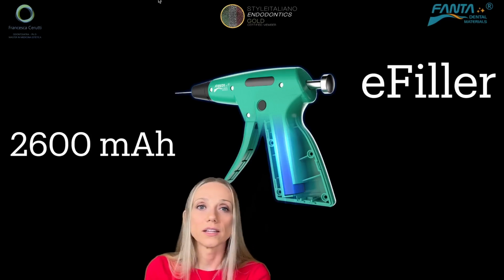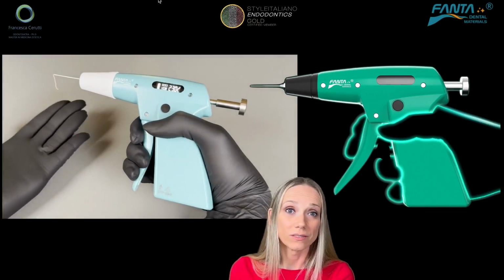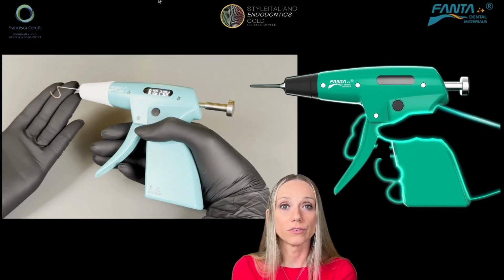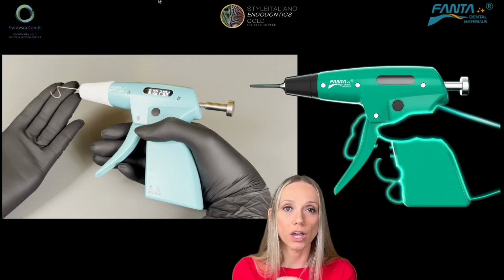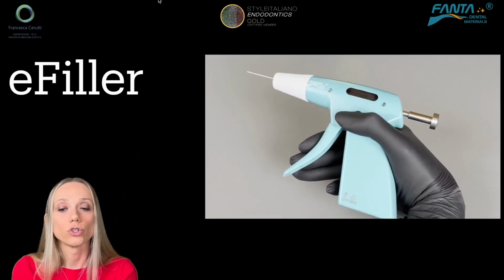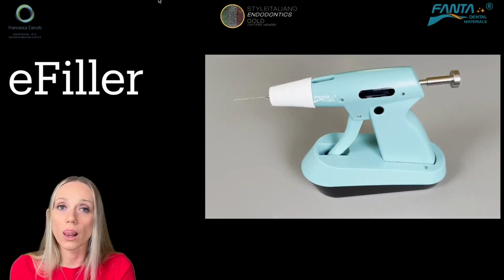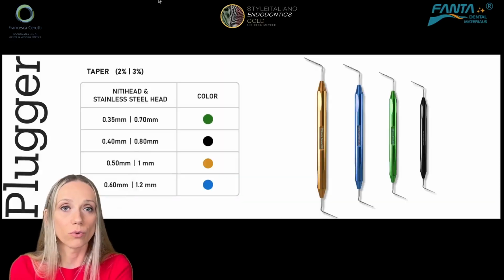And still, as the other device, the e-heater, it has a good standby time. It is quite easy to use with your hands. There is no particular problem in keeping the device straight or in the correct position. It's a good ergonomy, and then you just have to press and the gutta percha is going to be heated and is going to flow outside of the needle. So you put it into the root canal. And then what do you have to do? When you want to turn the device off, you just long press the button and you put it on its stand and it is ready to be used again.